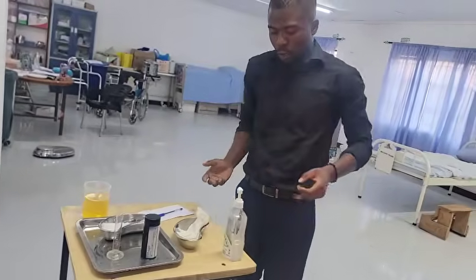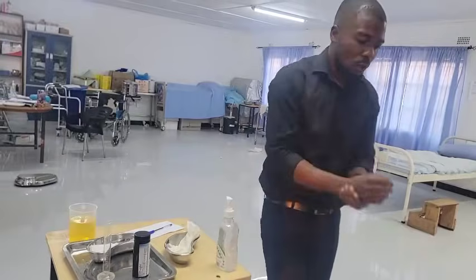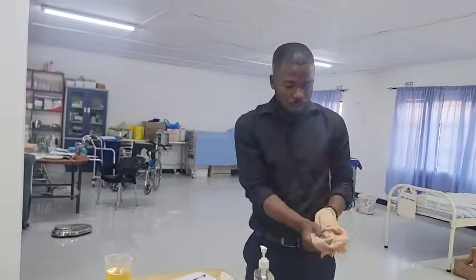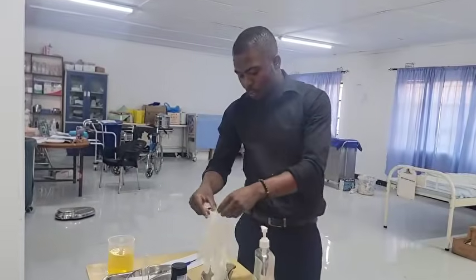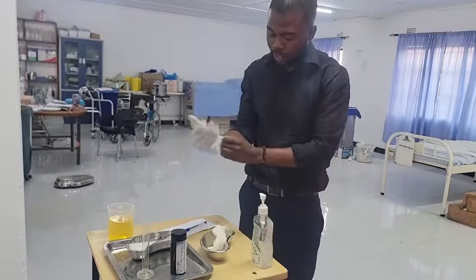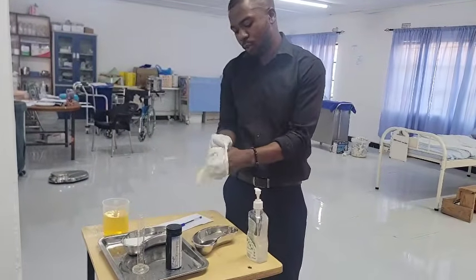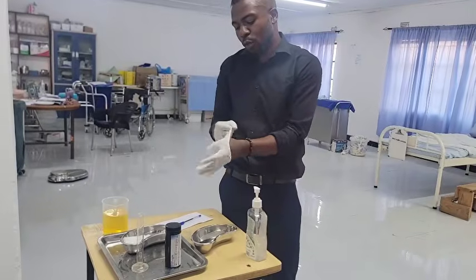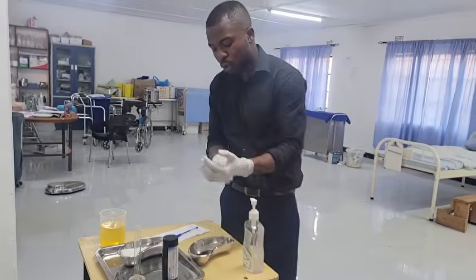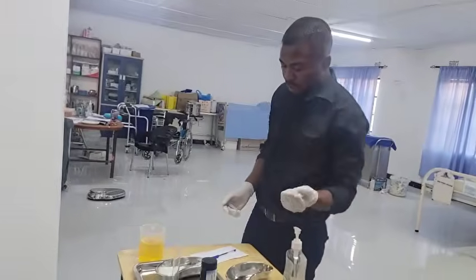Of course, you begin the procedure by washing your hands. So wash hands and dry them. Okay, then the next thing you do, you don clean gloves. There are issues of contaminating the bottle, so at some point we are going to remove this part of a glove from this hand.